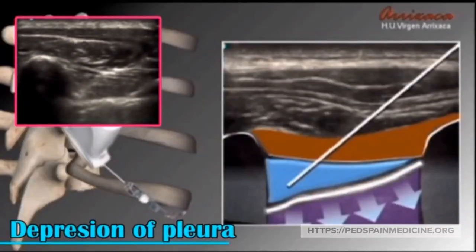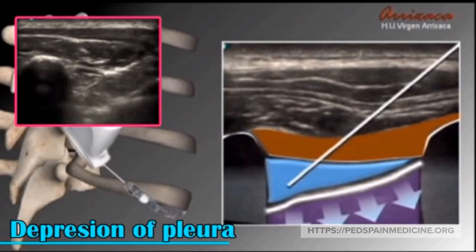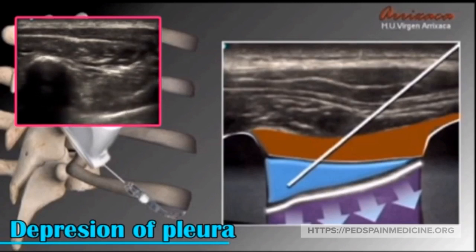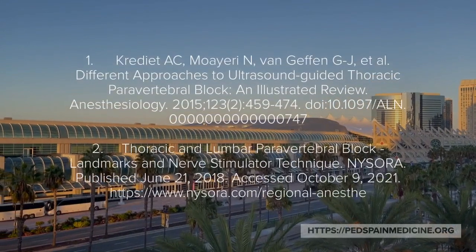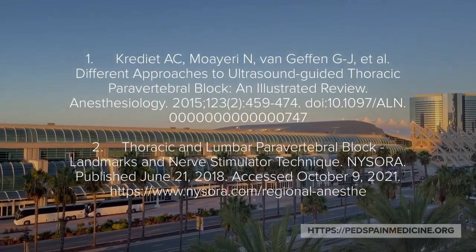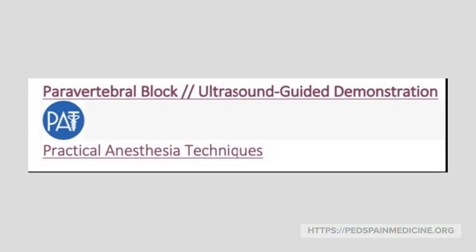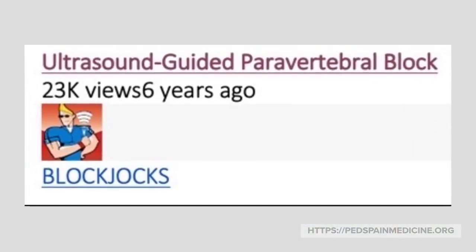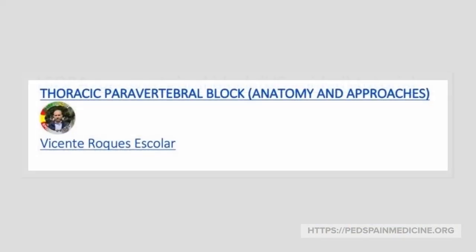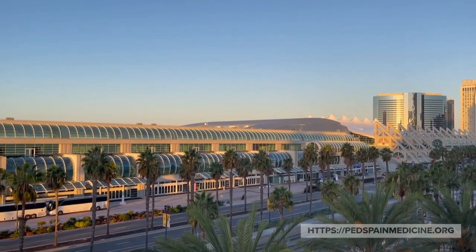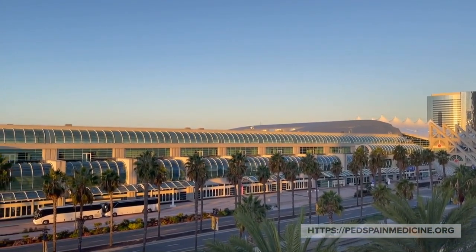Here is another video of a successful paravertebral nerve block with depression of the pleura. Here are articles on the paravertebral nerve block, and we have also used videos from the following sources. From the Society for Pediatric Pain Medicine, we thank you for your time and attention.